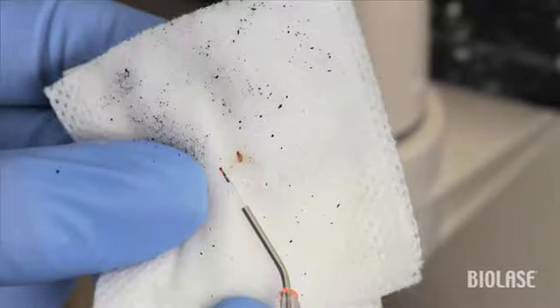You can see the diseased tissue accumulating at the end of the tip. To remove the tissue, gently wipe the fiber on a moist 2x2 and reinitiate the tip if necessary.